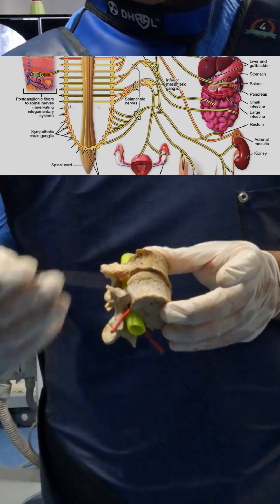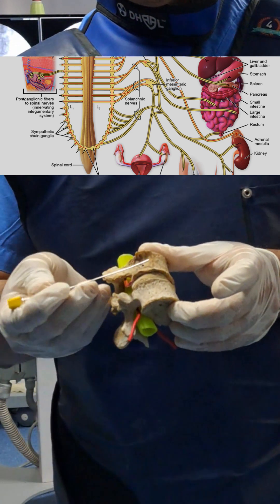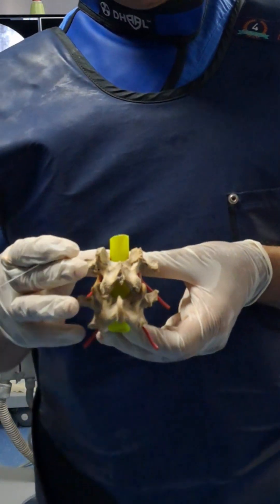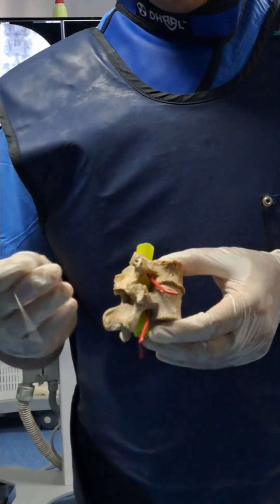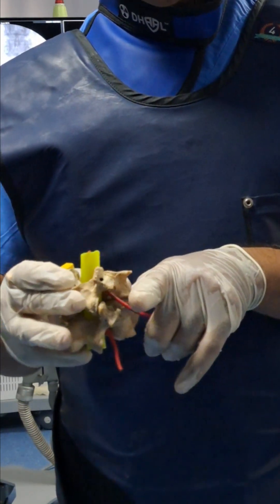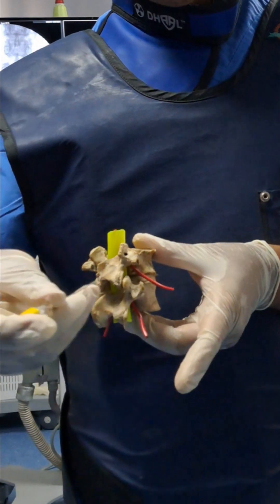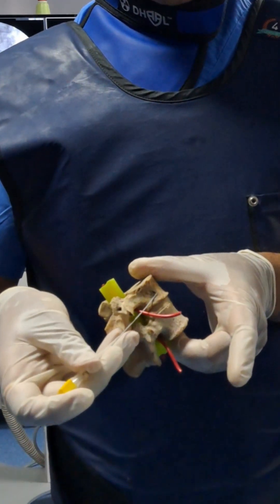For any lumbar sympathetic related procedure involving sympathetic overactivity, you should not miss the L2 level. Now I will show you the procedure: first AP view, then squaring of the L2 vertebra, then I will take the C-arm oblique so that the transverse process is touching the outer border of the vertebra. In that trajectory, the needle will go above or below the transverse process to reach the lower border of L2.